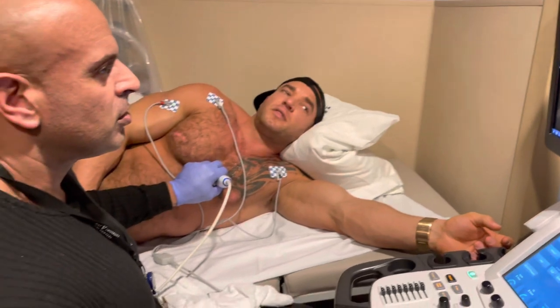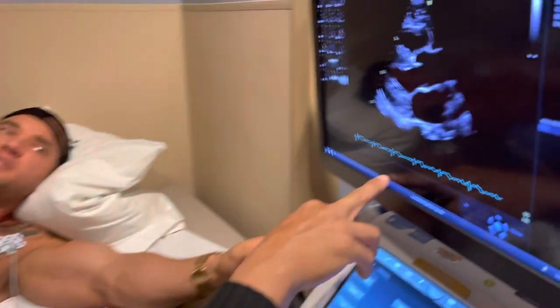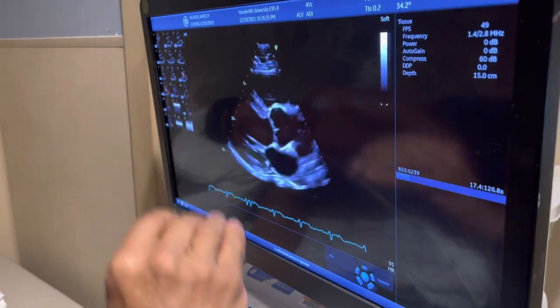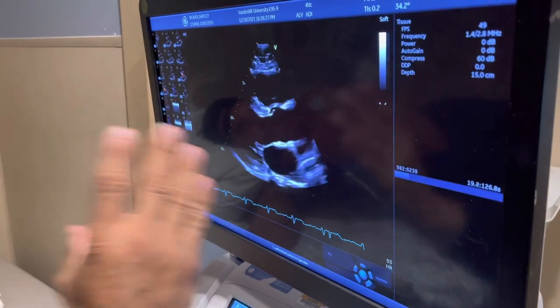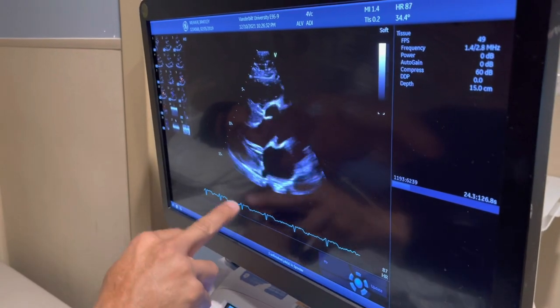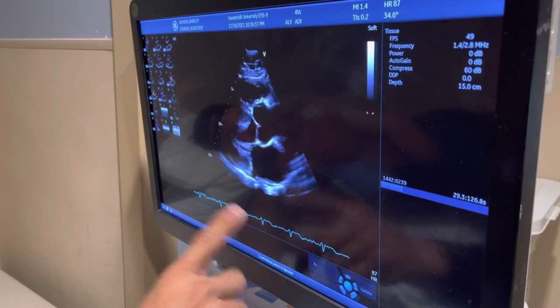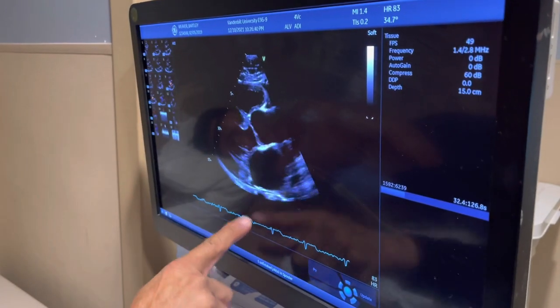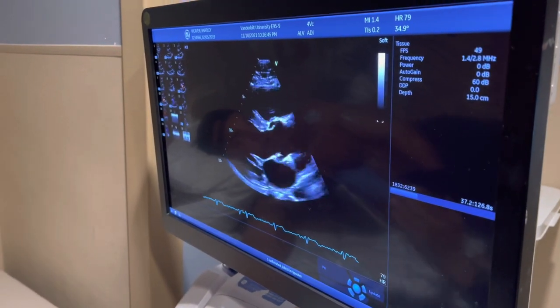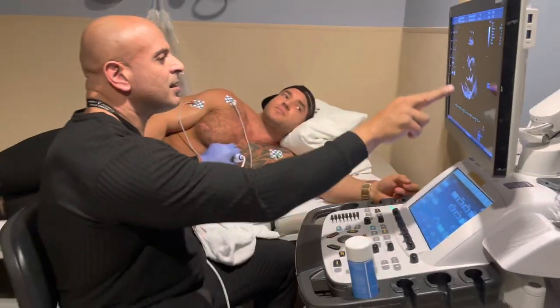How would you know if I had an arrhythmia? Would you be able to tell from this? You see how you're beating normally — consistent, normal. I can see it visually. Also, you have an EKG down here. Those V-shapes are called QRS's — each one is a contraction of the ventricle. Because they're spaced out evenly, that means you're in rhythm.